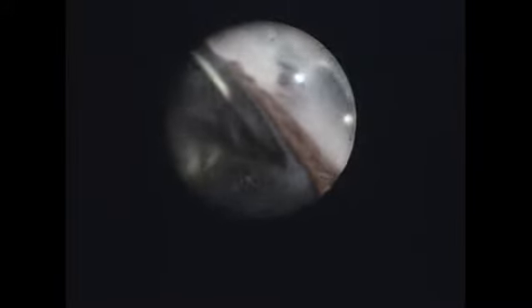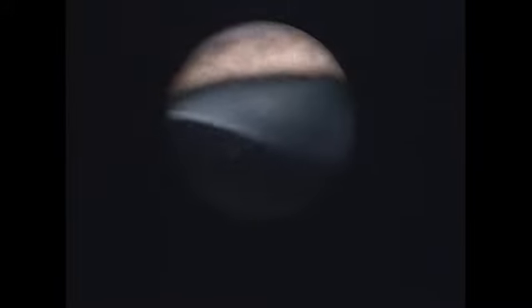Using endoscopic imaging, it is possible to certify that the IOL is in the bag, even in cases in which the capsulotomy is not continuous. The haptic loop of the IOL occupies the extremity of the capsular bag, keeping a distance from ciliary processes.